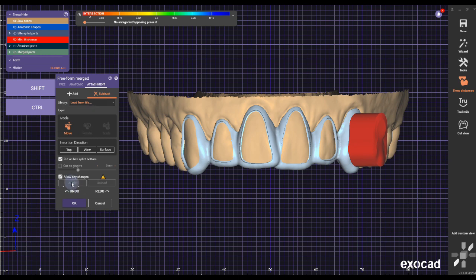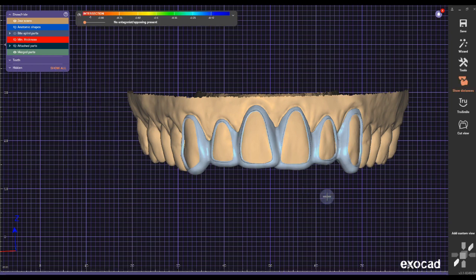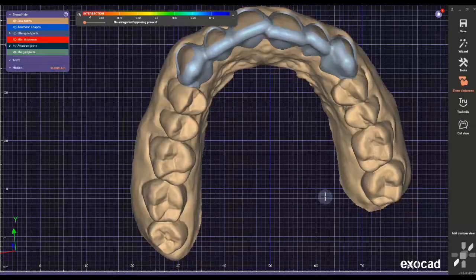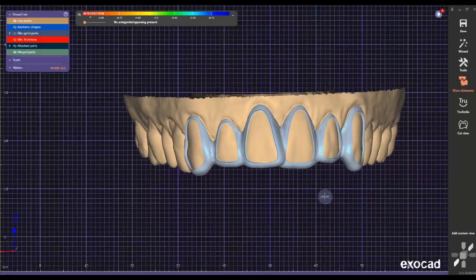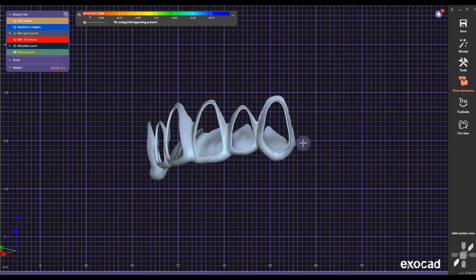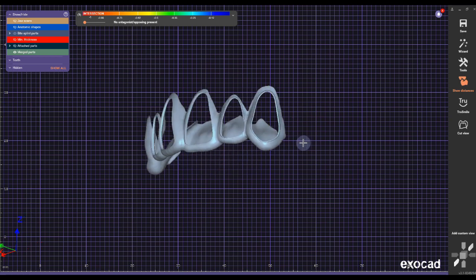Load each file one by one. When you've loaded everything, click OK and it will close the attachment module. That's basically the whole step — it's a really easy process. You can also use this for a gingival reduction guide by extending it a little bit. Maybe I'll make another video about that, but there you have it!